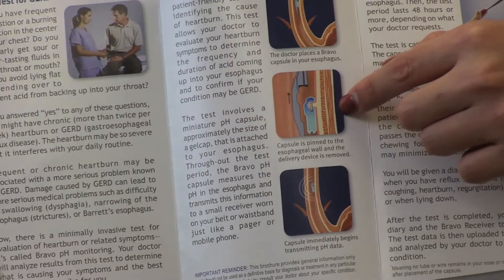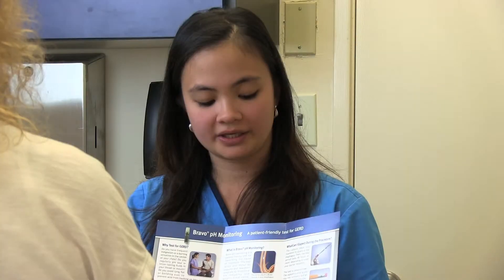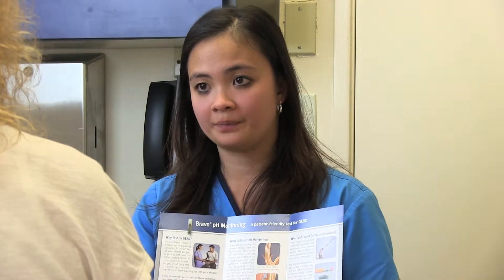With suction, it will suck a little piece of your esophageal mucosa and skewer it. Within 30 seconds, the doctor will release the capsule and take out the wire, so it's just the capsule that's sitting in your esophagus.